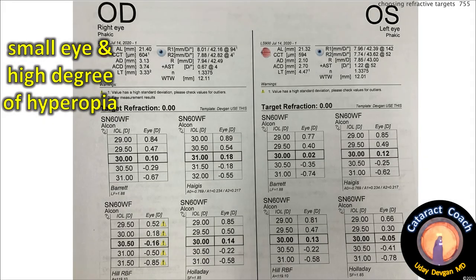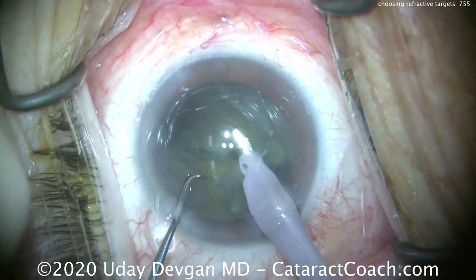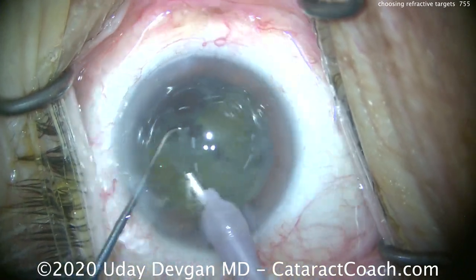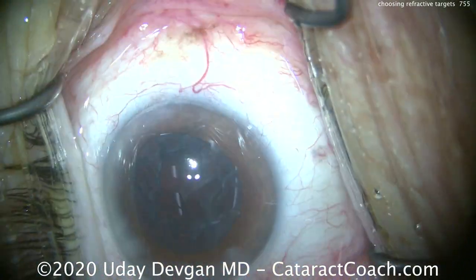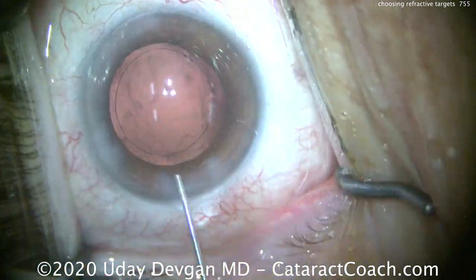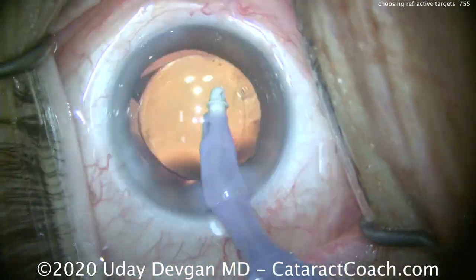Here's our next patient: small eye, high degree of hyperopia. This is a tough one. The lens calculations come back with 30 or more diopters for the lens power. We're going to chop in the capsular bag. This patient has a shallower anterior chamber, so we don't want to prolapse the nucleus out of the bag. Remember, these hyperopic eyes are small — make sure you make a sufficiently large capsulorrhexis, at least five millimeters, and chop in the bag to stay away from that shallow anterior chamber.